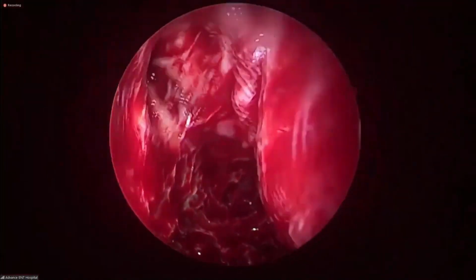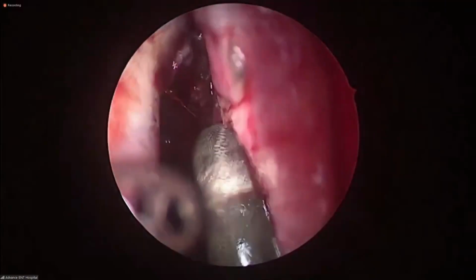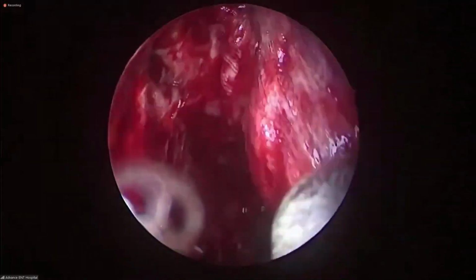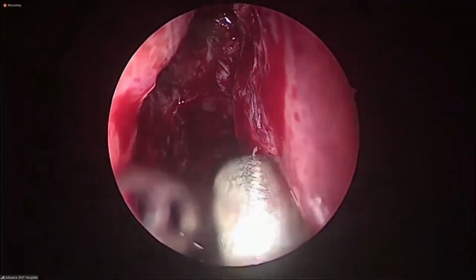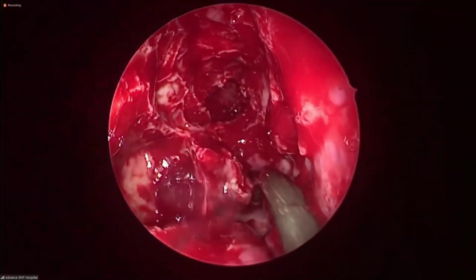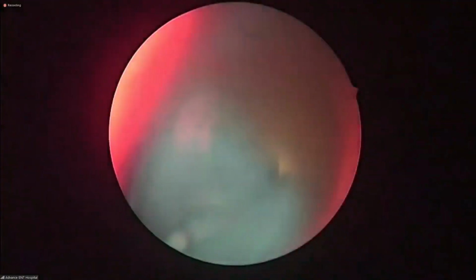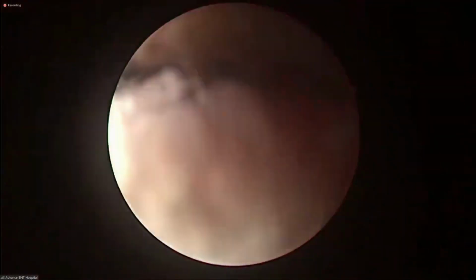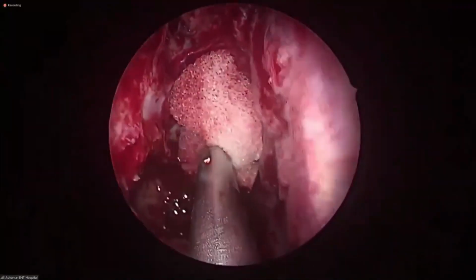See, from the frontal, both medial and lateral limit, we left the disease in the olfactory cleft and did a partial turbinate resection as a part of our strategy. See this disease in the olfactory cleft? I don't want to traumatize this mucosa. So this is all about this side, and that will be the end of the demonstration today.